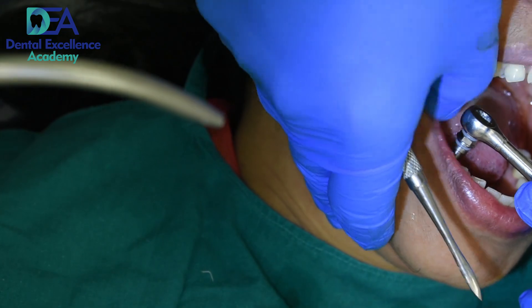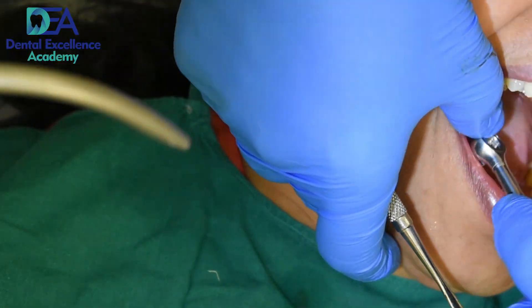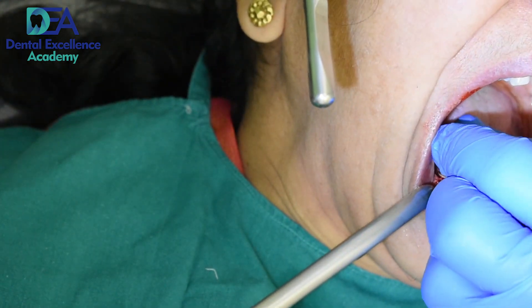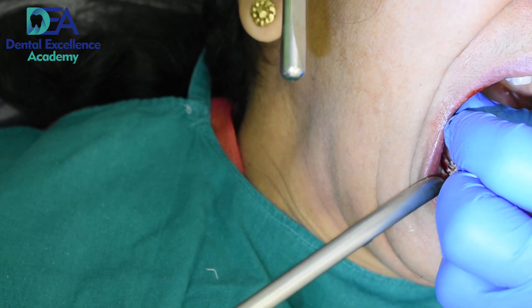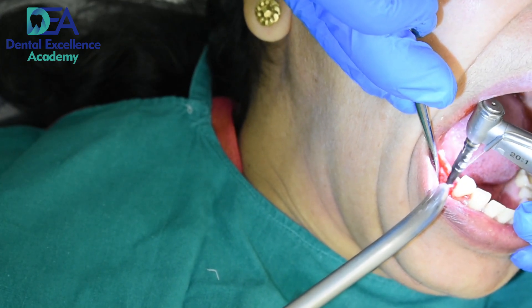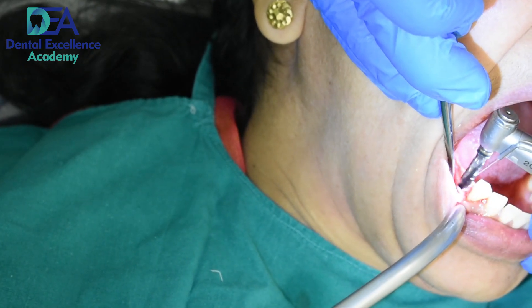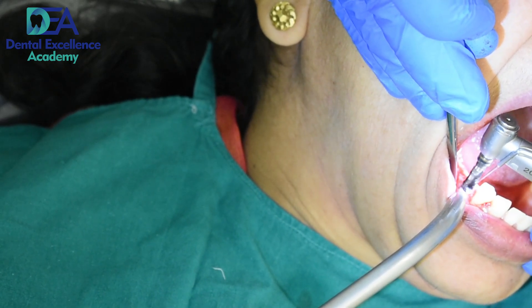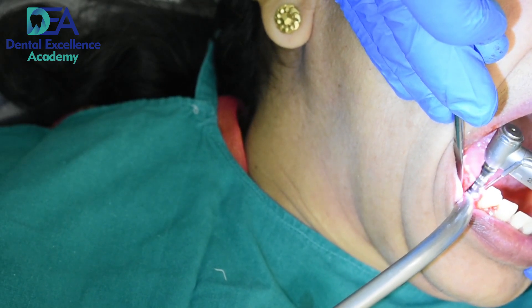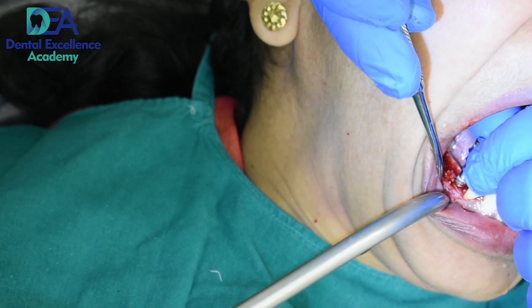We will try the implant directly. In some cases you have to under-drill. It is not going to the desired length, so we will shift to the next drill. You can see I am giving pressure more on the lingual aspect because we have very thin bone on the buccal side.